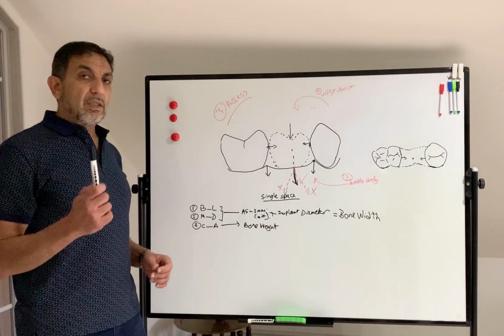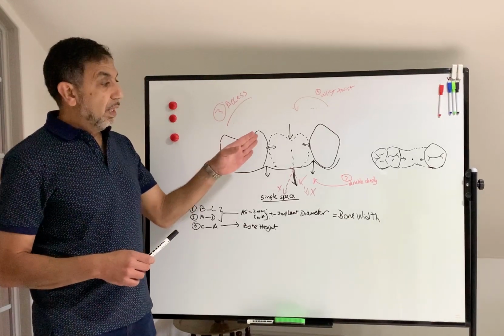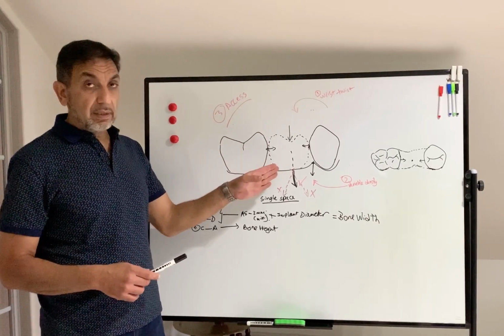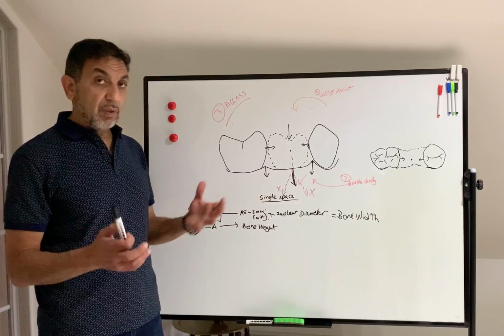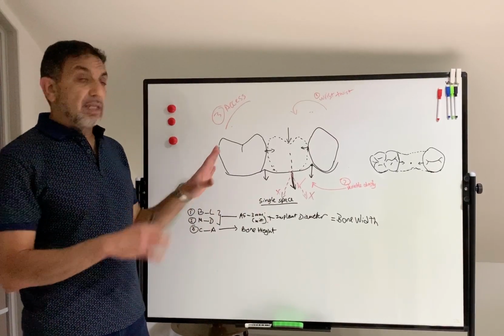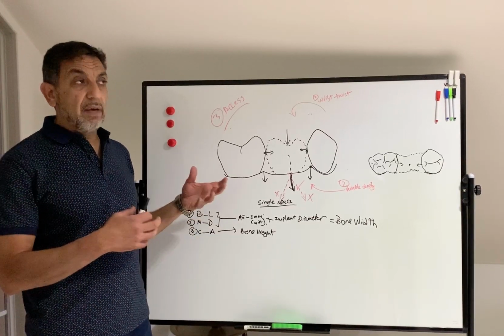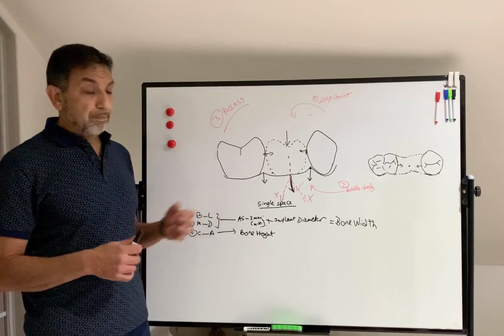Hi, today we're going to talk about how to position an implant, a single implant in a single space without a guide. Obviously, the guide will facilitate a lot of this, but for the sake of the argument, we have a case without a guide.